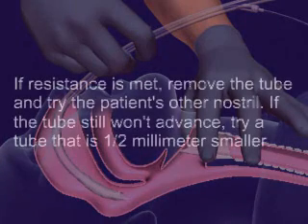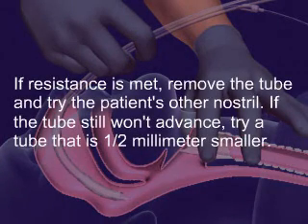If resistance is met, remove the tube and try the patient's other nostril. If the tube still won't advance, try a tube that is one-half millimeter smaller.